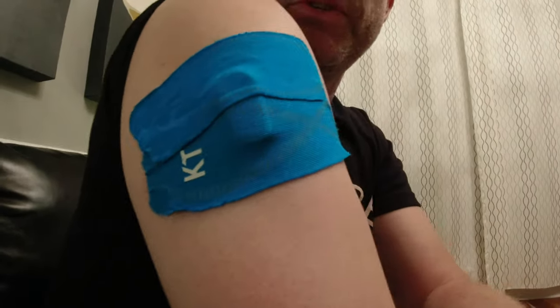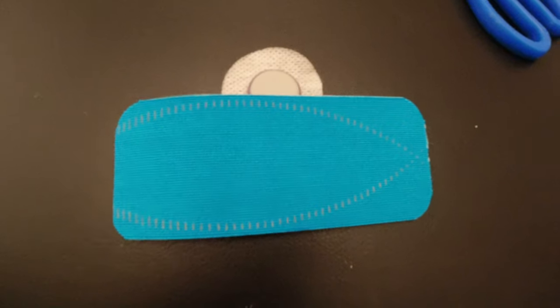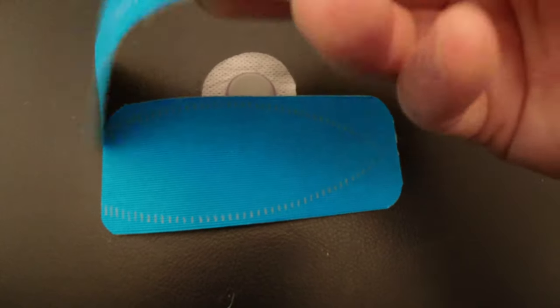I put my Dexcom on my arm — and I know that's not the right place to do it — but this is what it looks like when it is just sitting on your arm. I'm going to show you how to tape over your Dexcom to make sure it stays put. The first strip goes on the bottom. The second strip goes on the top directly across the Dexcom, and you want them to overlap a little bit — not a lot, just a little bit.